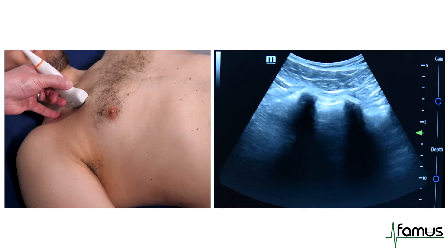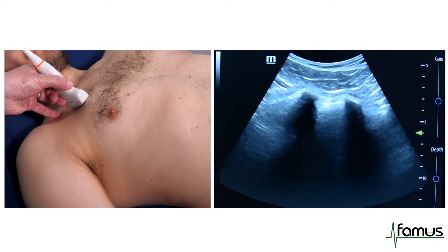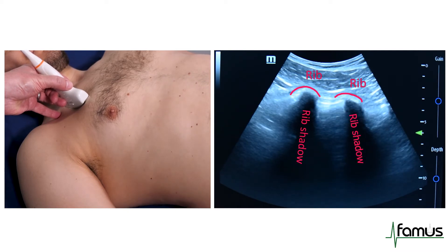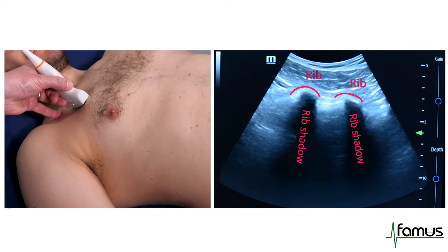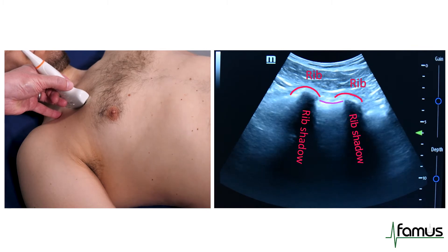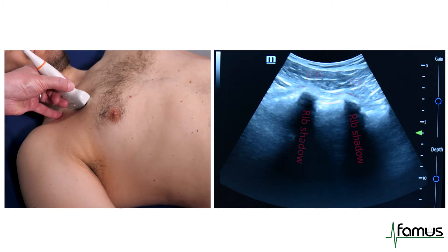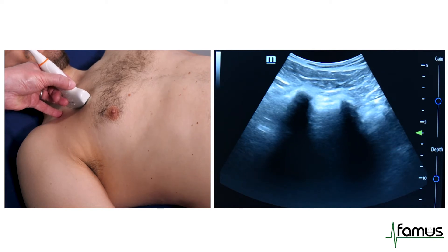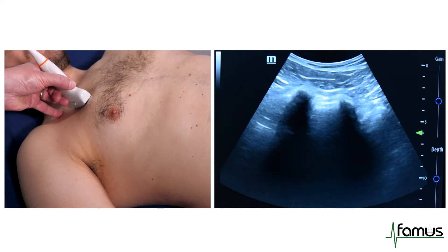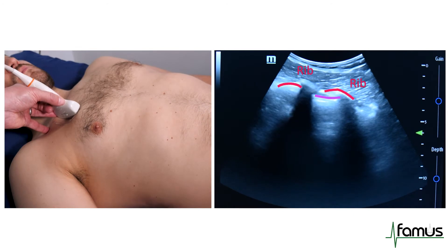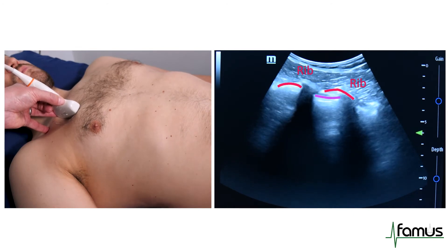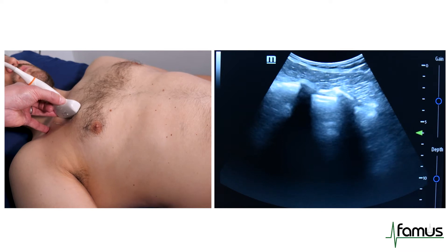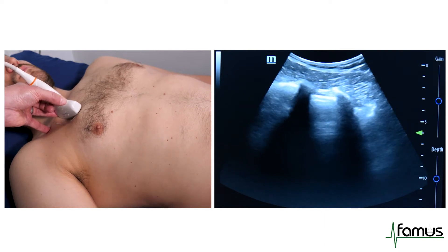The first position we're looking for is the upper anterior chest wall. You can see here we've got two ribs casting a shadow, the pleural line beneath the ribs in between, and you can see that sliding with respiration. This appearance of two ribs with rib space in between and a visible pleural line just below is the starting point for chest examination at any of the six lung zones.